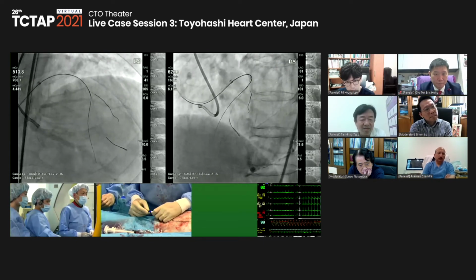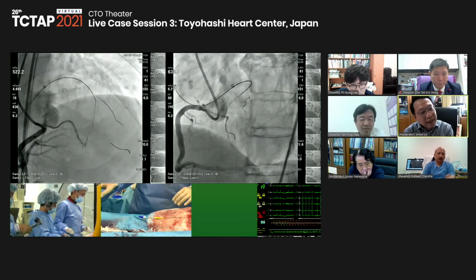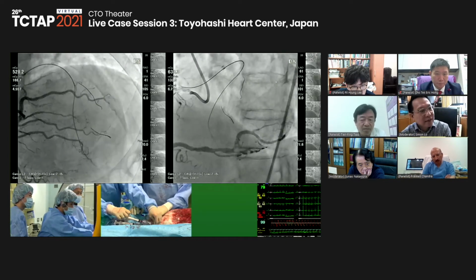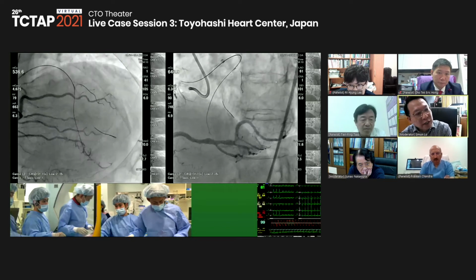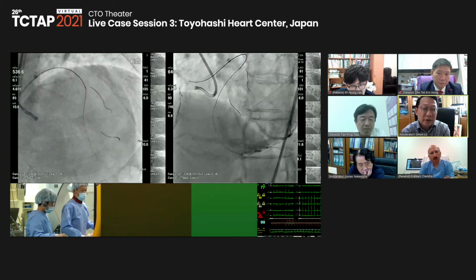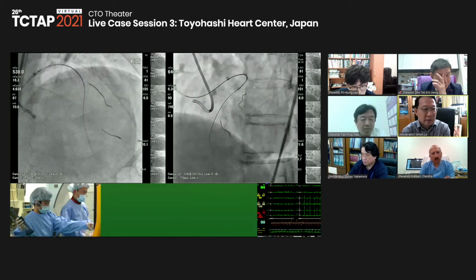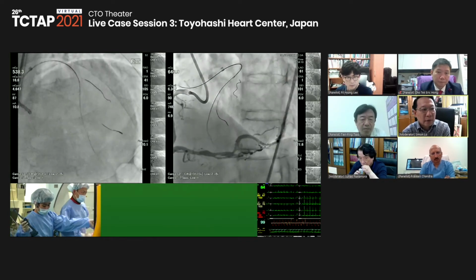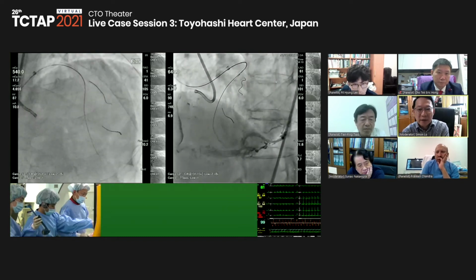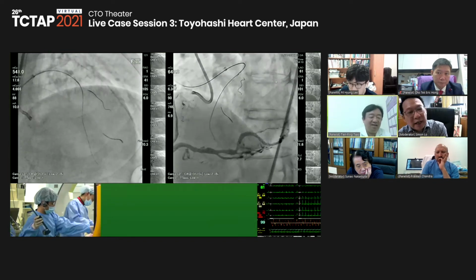So, well, as you're taking out the double lumen catheter, I just asked the panelists now, what is the next step? Would they use a single stent strategy, or would one consider, because that first diagonal is actually quite a sizable diagonal, would you consider stenting a diagonal and then a two-stent strategy, or would you use a single stent strategy? Dr. Xiao from Taiwan, would you use a single stent?